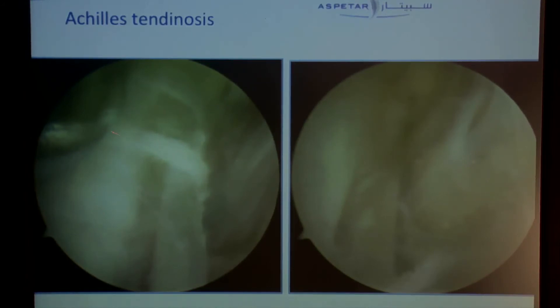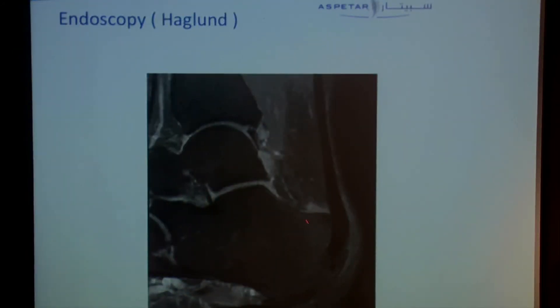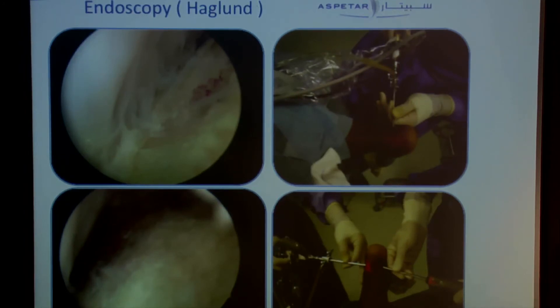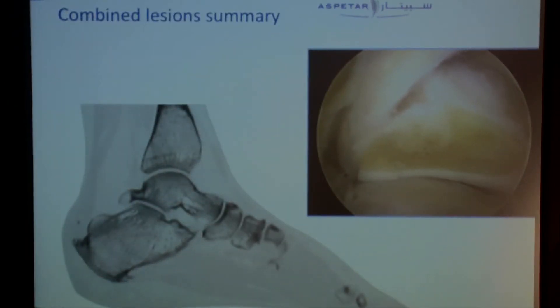Here you can see those adherences during arthroscopy. When you remove them, you can remove a lot of pain, and due to the denervation of the procedure, we now have indications to do it arthroscopically. For Haglund deformity — a conflict of bone on tendon at the posterior side of the ankle — we do the same: we remove the bony prominence at the Achilles tendon insertion, clean it out, and with a two-portal technique it's feasible with minimal morbidity and quick return to play.